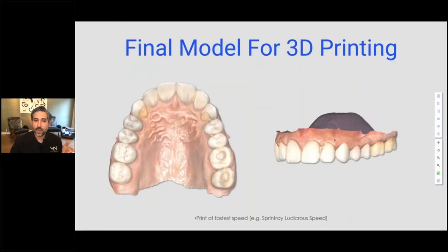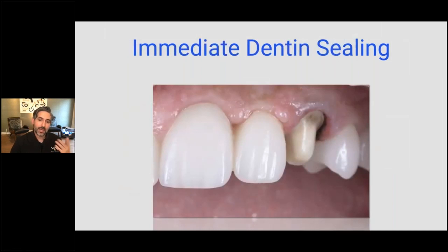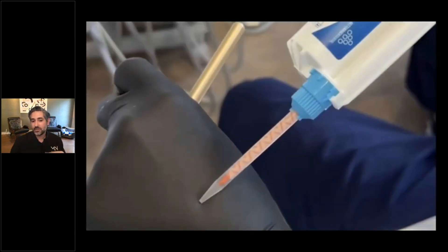This is the final model for 3D printing. We use the fastest speed my printer has — it's called Ludicrous Mode — and it prints really fast. Between everything, it was less than an hour between printing, washing, curing, and making the provisional, so I was able to get it done during the appointment. Meanwhile, I cleaned up the prep. One of the things I do is called immediate dentin sealing — that's one of the key things that improves adhesion and minimizes fracture of ceramic and complications. It's part of biomimetic dentistry and something I teach in my courses. I took my final scan, and just when I was ready to provisionalize, the putty was ready.